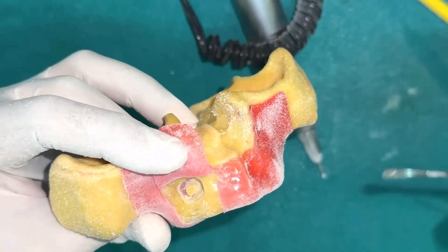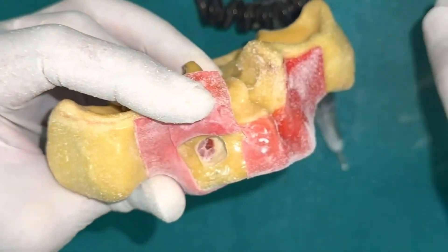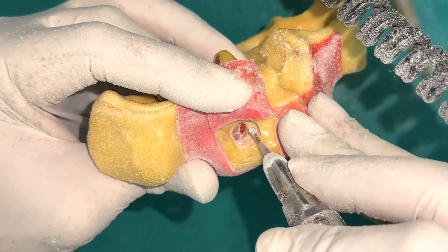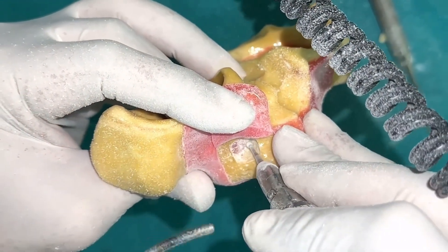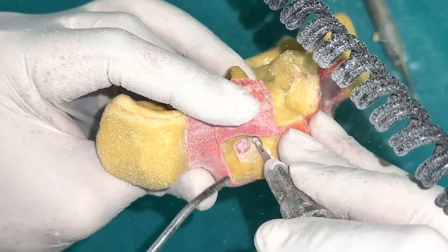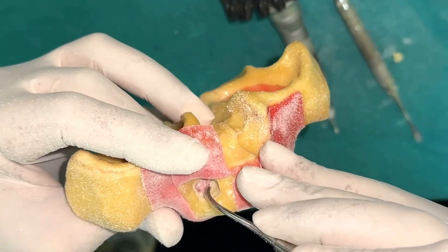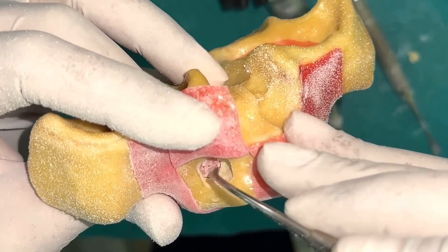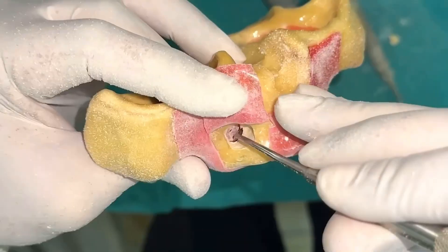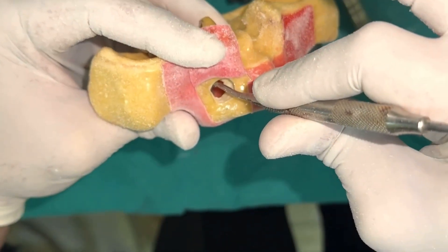Now we will try to fracture the bone window. This has been fractured — this is the bone part which has been removed. There is slightly some bone part remaining, so in that part also we will try to remove the bone. This is a preclinical model demonstration. Once we have removed the bone, we can use these sinus lift curettes to try and lift the membrane. You can see this is where the micromotor had touched it slightly, so the membrane is slightly perforated from here, but otherwise these are the curettes we use to lift the membrane. Once lifted, this is the sinus lift obtained.